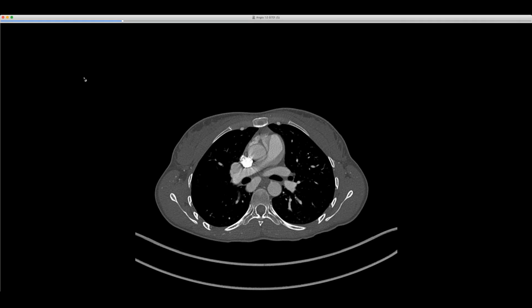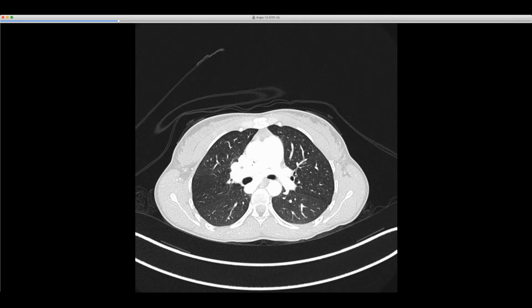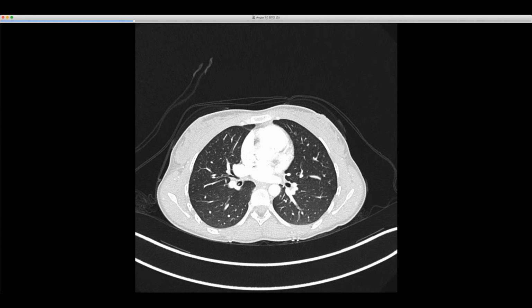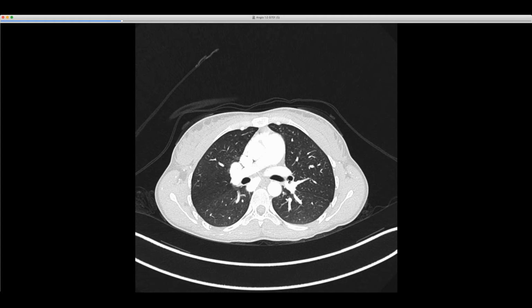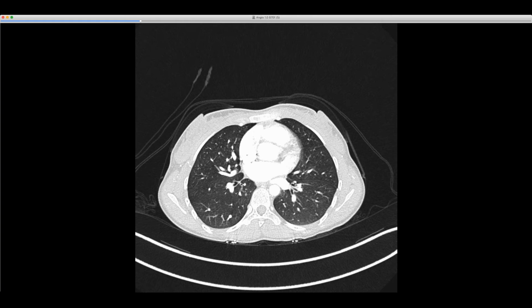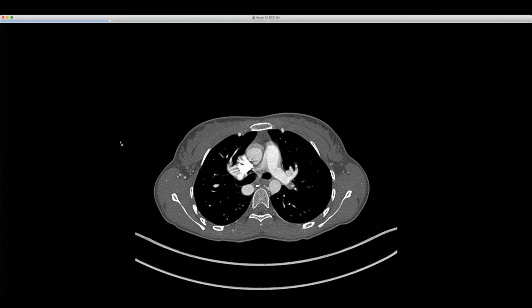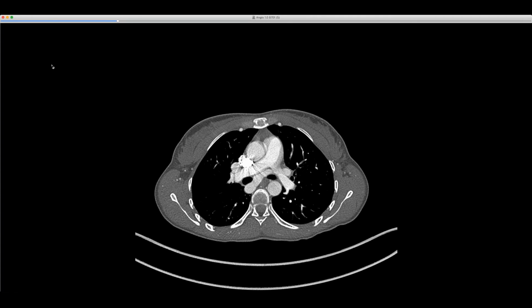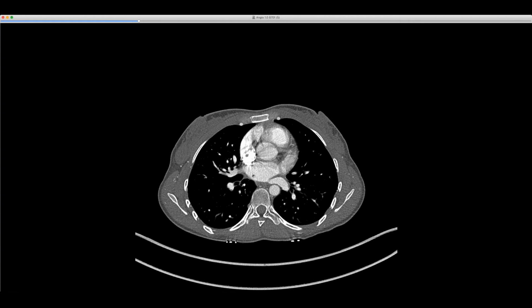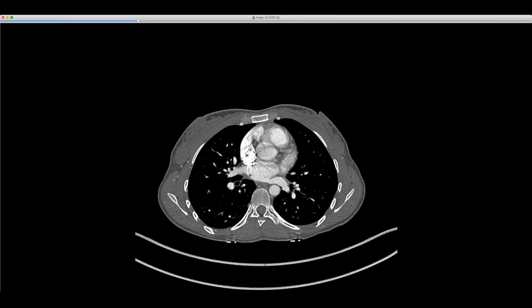Hey, Brent, was the bronchial anatomy fairly conventional? Or the lobar anatomy? I thought so. Here's what looks like middle lobe, and here's the upper lobe. It looks normal on the right, and a longer bronchus here, and then it looked normal to me. Okay. Just wondering if this was in that spectrum of scimitar, meandering vein variant, pseudo scimitar with some airway anomalies too. Well, that's really cool. And you said the right pulmonary venous ostia are normal? Here's a normal inferior, and then that's normal.